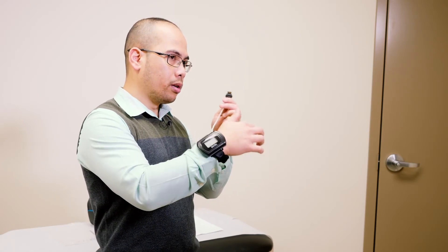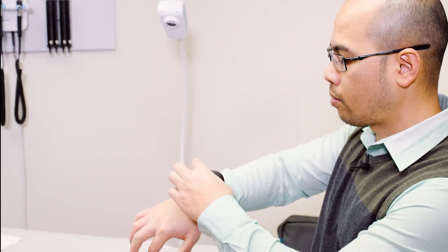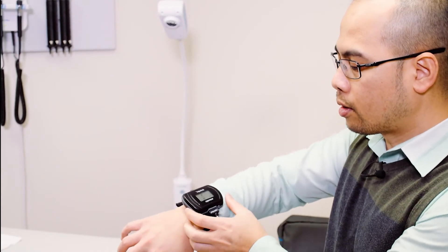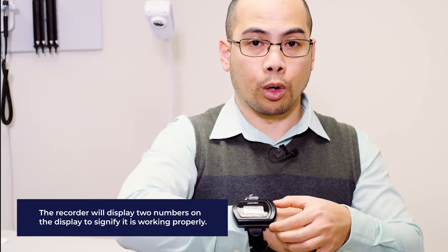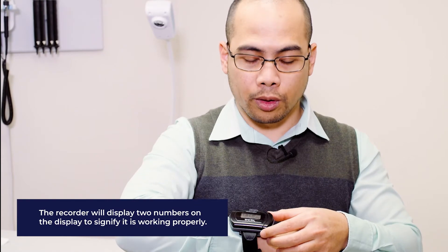This sensor needs to be attached to the main recorder through the port here. Once you've properly attached it, you can see that the recorder will turn on. You don't need to press any buttons. Once it's properly attached, the recorder will start recording and it's going to record until you take it off the following morning. This is the whole setup — it only involves the recorder worn around the wrist and the finger sensor on the tip of the finger attached to the main recorder.